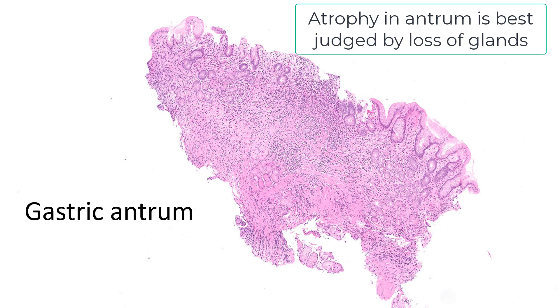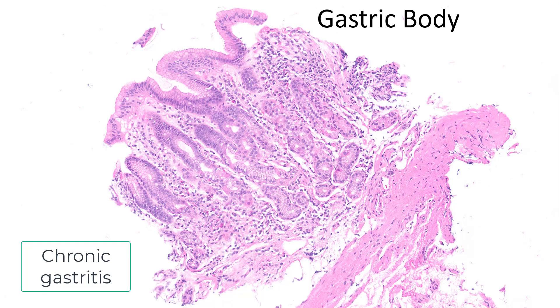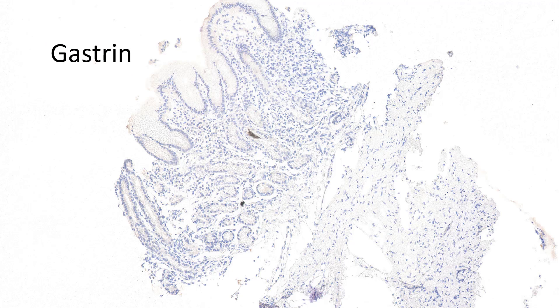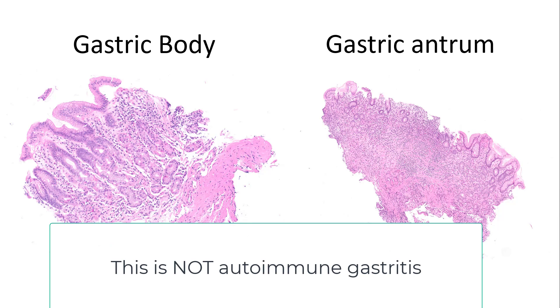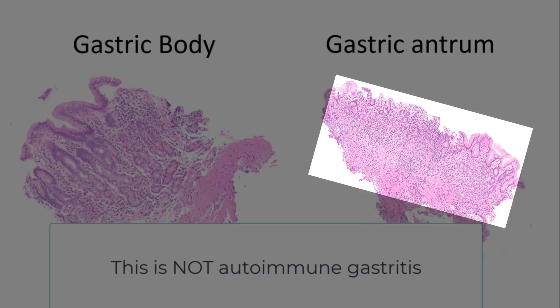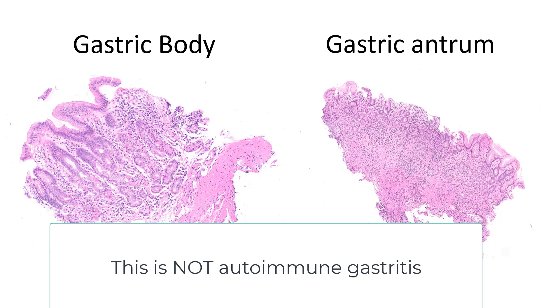There was no intestinal metaplasia here. Here's the body mucosa — again, there's significant gastritis, it goes superficial and also deep. This was negative for H. pylori gastritis. The gastrin stain was entirely negative, confirming this is from the gastric body. So the question is: is this autoimmune gastritis? And it is not. One reason is because you have a very diseased antrum — perhaps there's some atrophy in addition to chronic gastritis. The body clearly shows chronic gastritis, but it does not show neuroendocrine cell hyperplasia. Therefore, this is not autoimmune gastritis.